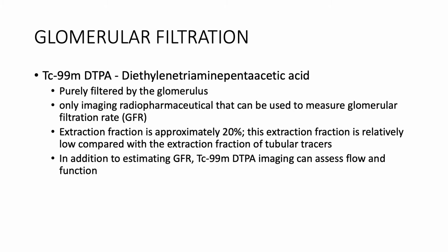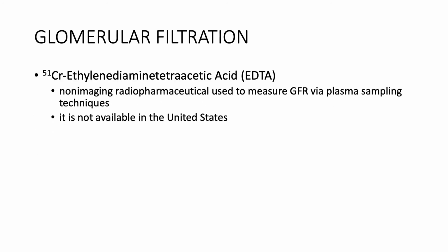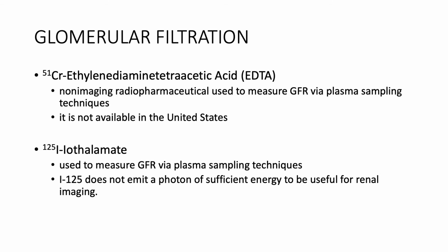In addition to estimating GFR, technetium-99m DTPA imaging can assess flow and function. Other radiopharmaceuticals excreted via glomerular filtration are usually used to measure GFR via plasma sampling and are not used for imaging. These are chromium-51 ethylenediaminetetraacetic acid, or EDTA, and iodine-125 iothalamate.